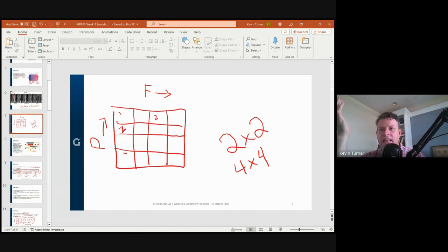Yes, that's exactly why the localizer scans suck. When you say the localizer scans suck, what you mean is that they are low resolution images. And the reason that they are like that is because they run really fast, so you can see the outline of your anatomy without having to wait a long time. So the size of the pixel determines how sharp the image is, right?